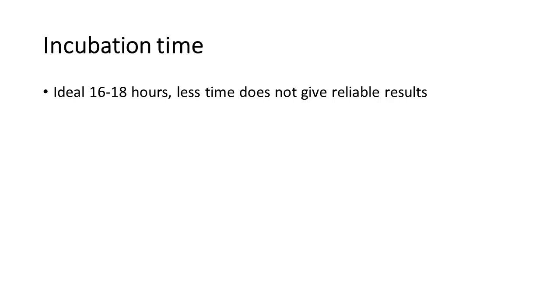That means when the temperature increases, we have to reduce the time. For example, if we keep it at 35 or 37 Celsius, you can keep it 16 to 18 hours. But if you keep it at room temperature, that means 25, you have to keep it a long time, 2 to 3 days or more, that means 3 to 7 days. Okay.